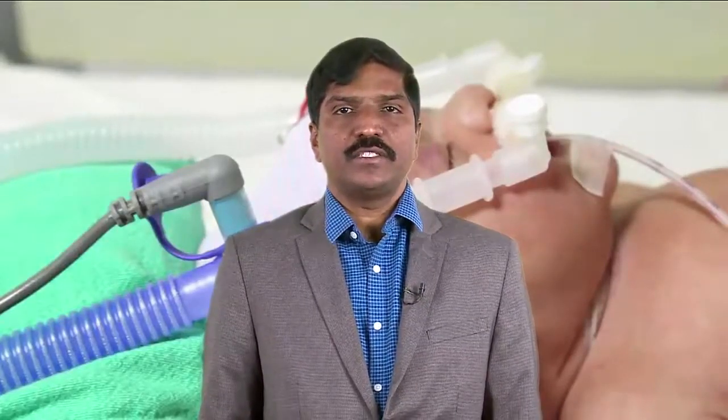The steps of CPAP application to a newborn include connecting the newborn to a pulse oximeter, fixing the cap of the right size, fixing an appropriate type and size of nasal interface, checking the CPAP circuit for air leaks, and then connecting the CPAP circuit to the nasal interface. These two figures depict two newborns supported on CPAP, one with Hudson prongs and the other with Fisher and Paykel nasal prongs.